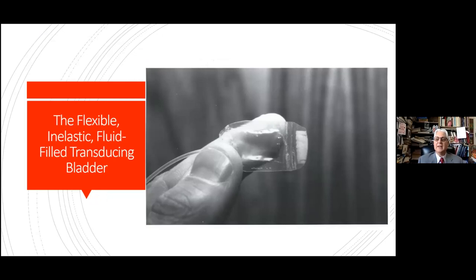So to get a material like that, we had the little blister packs that you open up, like sterile tetracaine in, and the plastic wall of those was very convenient in the sense that it was flexible, but if you sealed it off, you couldn't make it expand with the pressures that we're looking at. And thankfully, the material is heat sealable. So I was able to seal the two sides of this together.